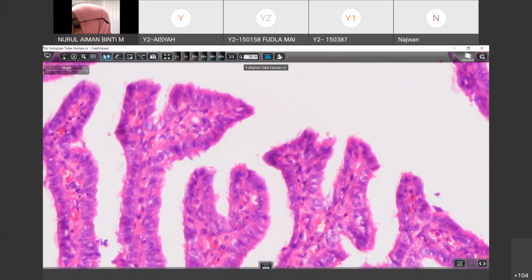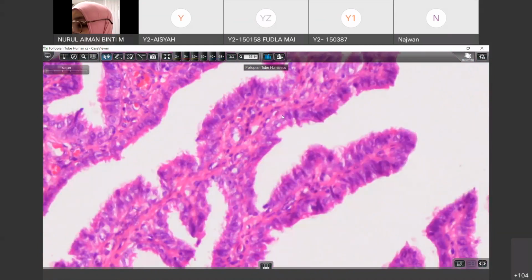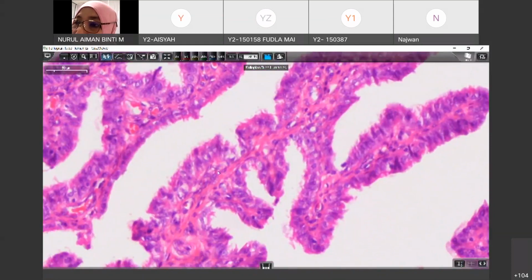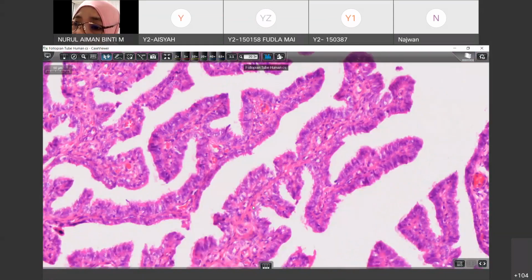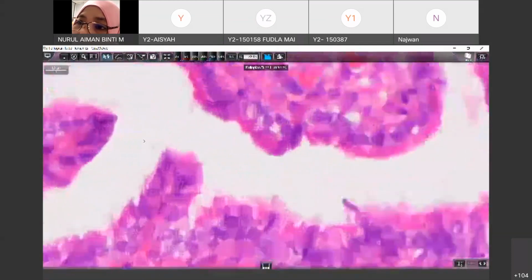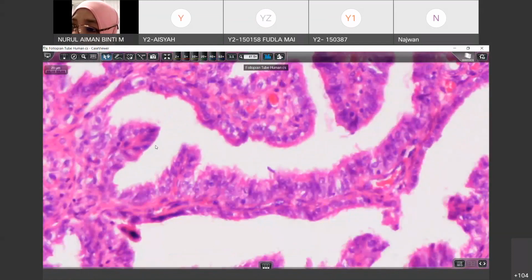Okay, so basically you are not that lucky, but of course, if you look inside our lab, if you manage to find a very nice slide, sometimes the old slides are very nice, but here the staining is really distorted. You can't find the peg cells. Very compact. Maybe here. Okay, maybe this is part of the peg cells, but it's not that clear.